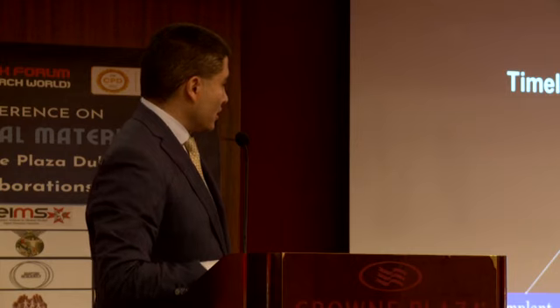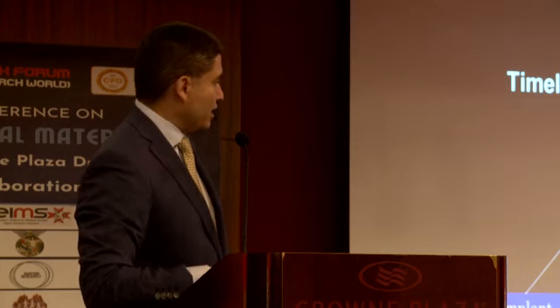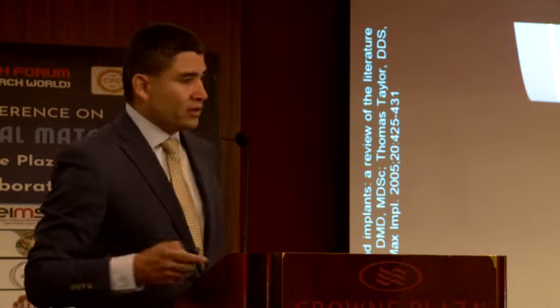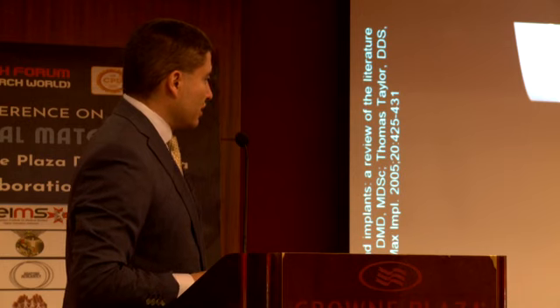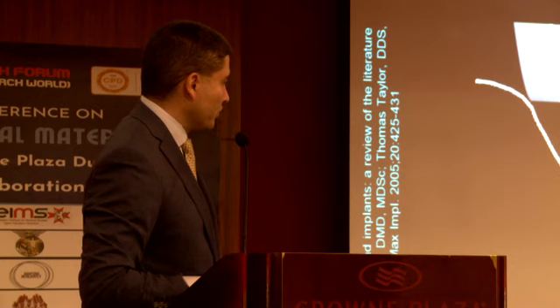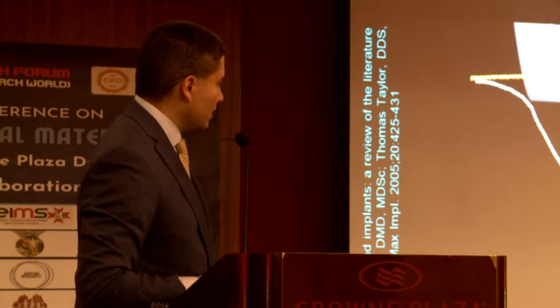So we understand that the elements for the time of osseointegration around implants are directly related to the quality and quantity of bone at the recipient site, the implant design, and the surgical technique. And these all give you primary stability. We understand that very well. Okay? And we understand the curve of osseointegration presented by Raghavendra and co-workers in terms of the primary stability by mechanical retention and secondary stability by osseointegration.